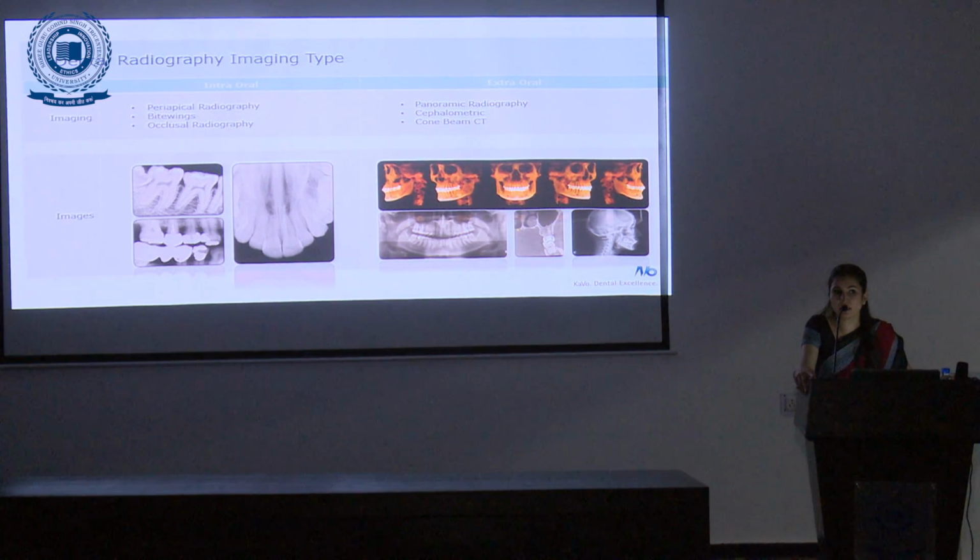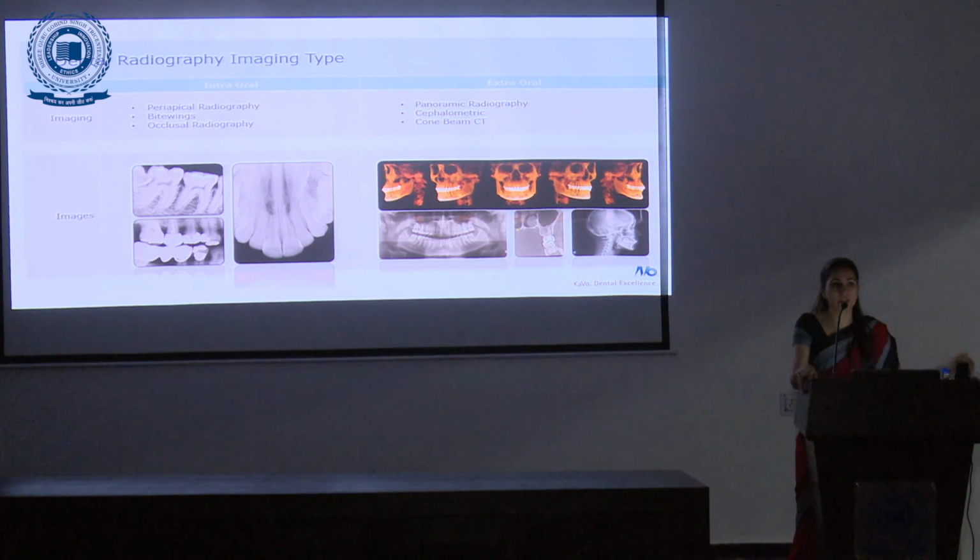And then comes the CBCT. The concept of CBCT is that the machine rotates 360 degrees around the patient and captures images from different angles. If it rotates 360 degrees and takes one image at every degree, there are 360 slices that we have. It's kind of like a book or a stack of coins. You have slices, you work with the algorithm and reconstruct, and you have your virtual skull in front of you. We will see it very soon in the software.